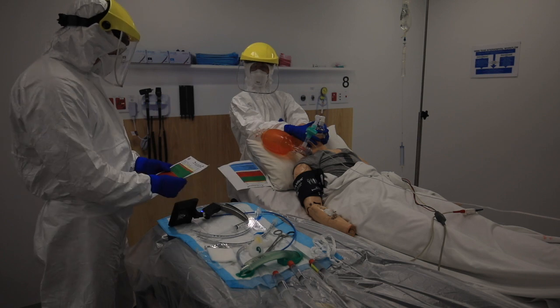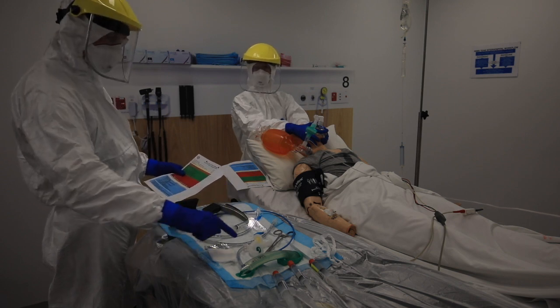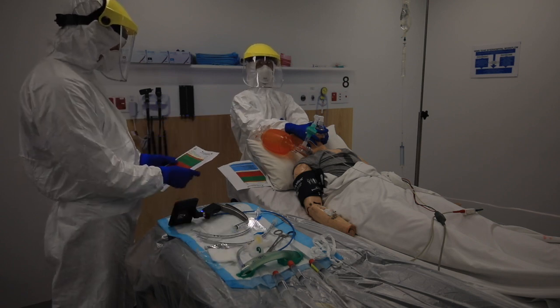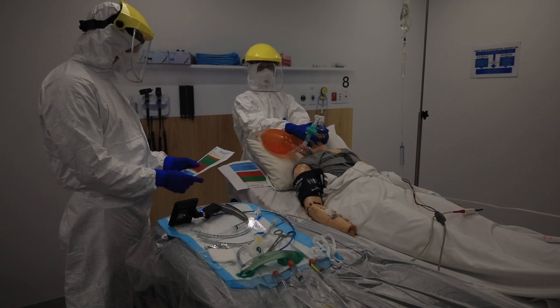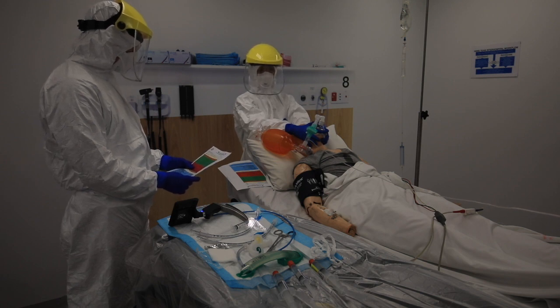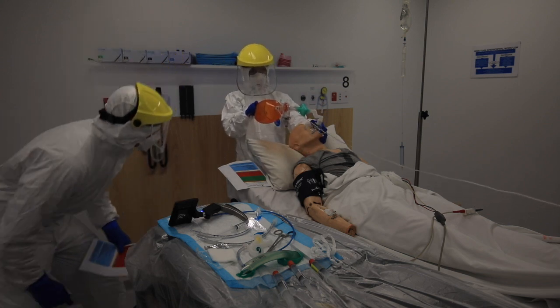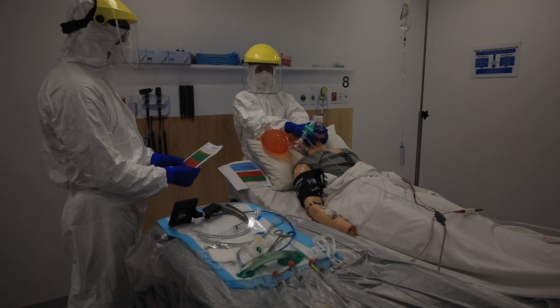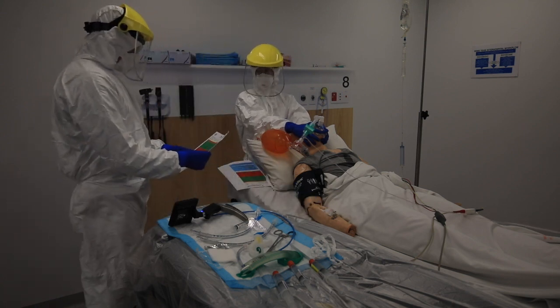Bougie chosen and shaped — blue one out, check. Gauze — check. Clamps — check. Eye gel — check. Needle cric is out in the cold zone, identified to our runner — check. Monitor applied — check. Hemodynamics optimized, optimal position — head up 45 degrees, ramped, sternal notch aligned — check. Looks pretty good. Suction tested — check. Fluids run easily — check. NIBP off the arm — check. Second access confirmed — check.